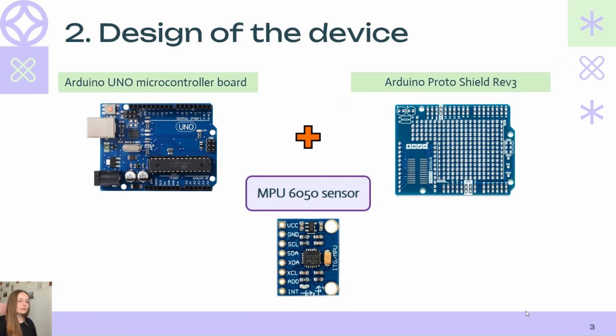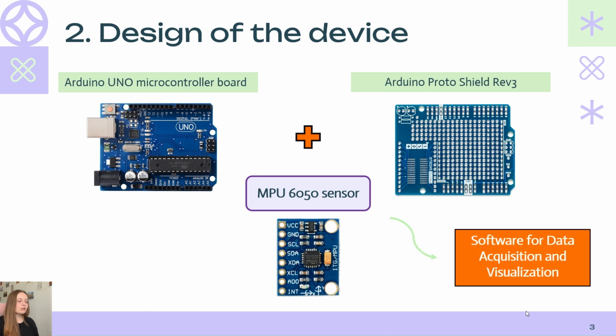Regarding the design of the device, the instruments that we used were an Arduino Uno microcontroller board, an Arduino ProtoShield Rev 3, and also an MPU 6050 sensor. We also developed an application in Arduino for the acquisition and capturing of the data. This device is supposed to be placed on the head of the patient with the help of an adjustable and elastic band.